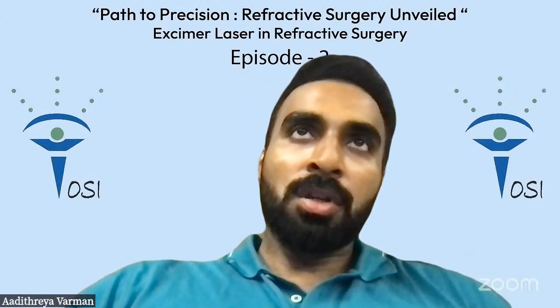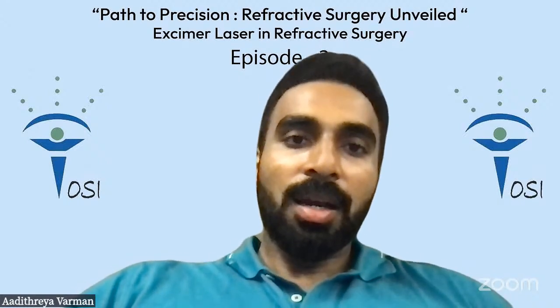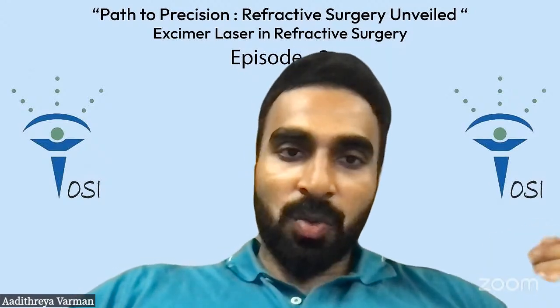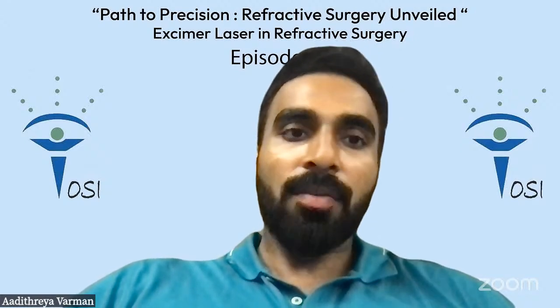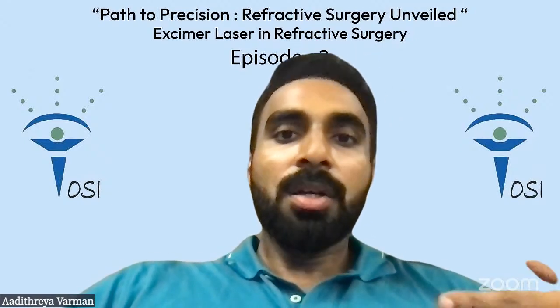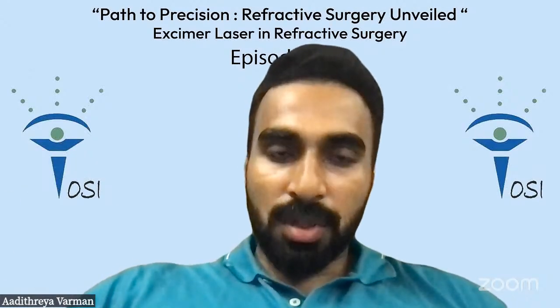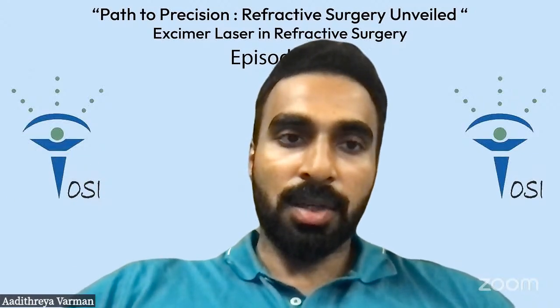But his distance vision in the non-dominant eye with that kind of refraction is only 6/18. But post-Presbyon with the spherical aberration and with the minus 1.5, the patient reads even 6/9 for distance while having the N5 or N6 for near. So that's when the blend happens. That's where the magic happens essentially. So there's a seamless fusion, and then the patient is binocularly good for both distance and for near.